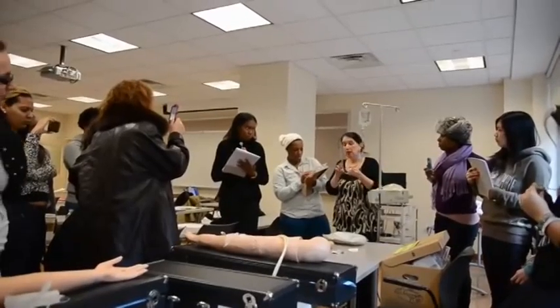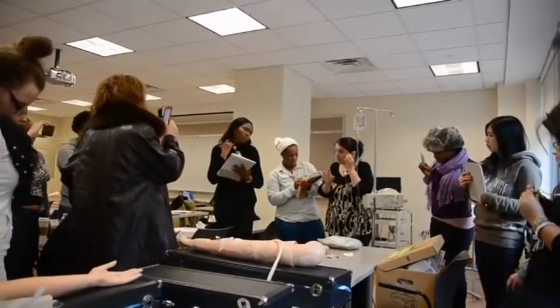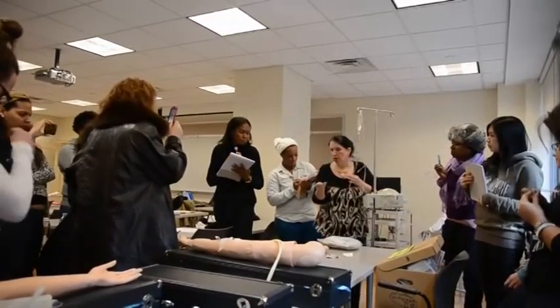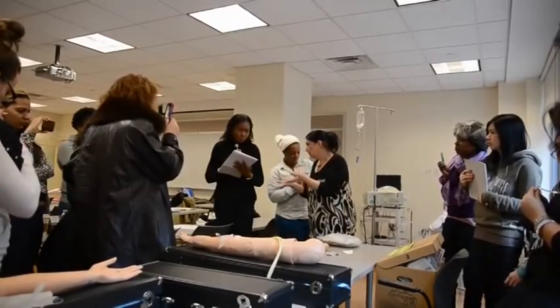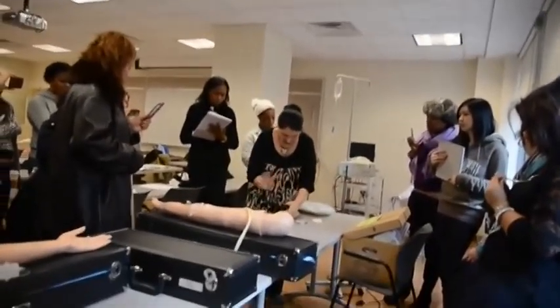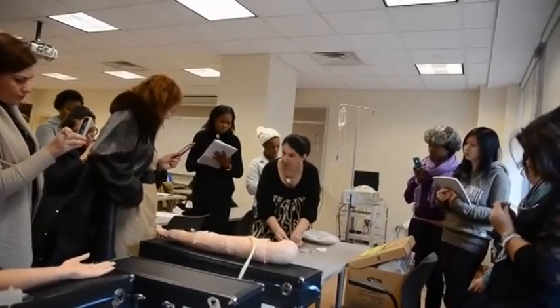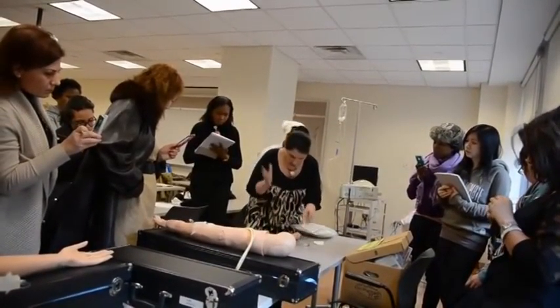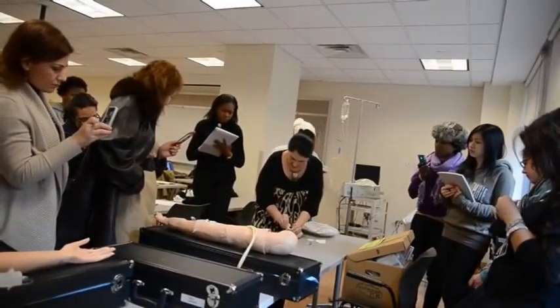I'm going to find out about the allergies and check the site — you're going to do all of that. You don't do anything until that. So now I'm going to put on a pair of non-sterile, clean gloves. I already assessed the site. I IDed the patient. I did all of that. And now what I'm going to do is this has to be clamped. I'm going to come with my gloves on and wipe off the site.